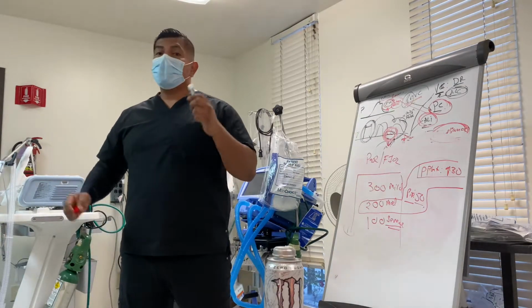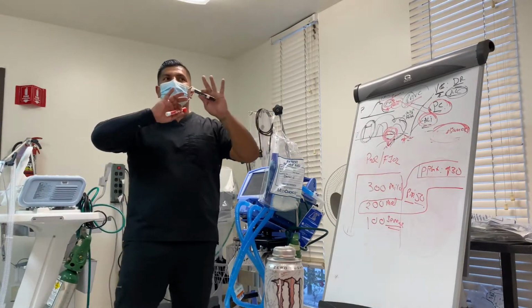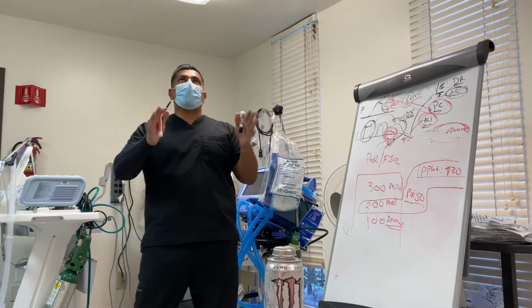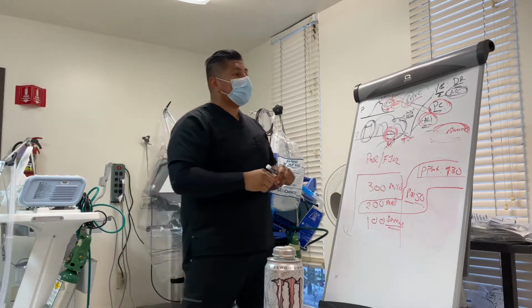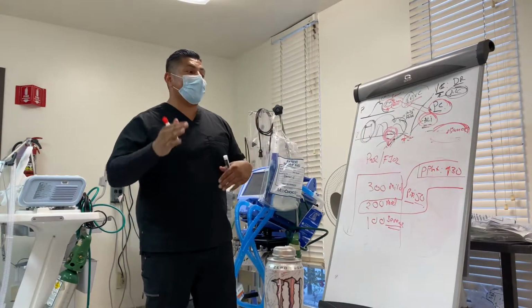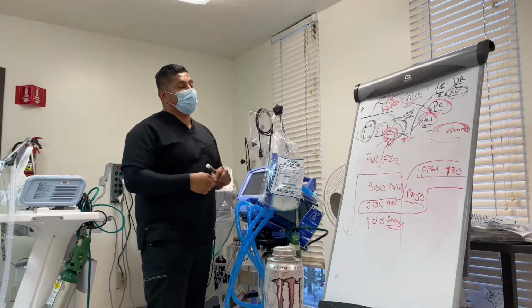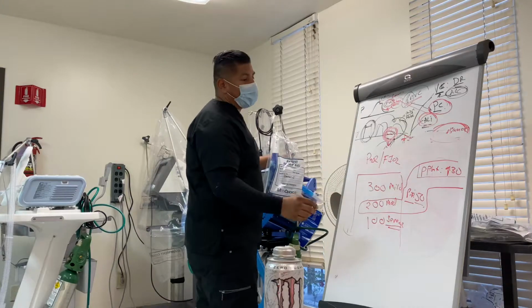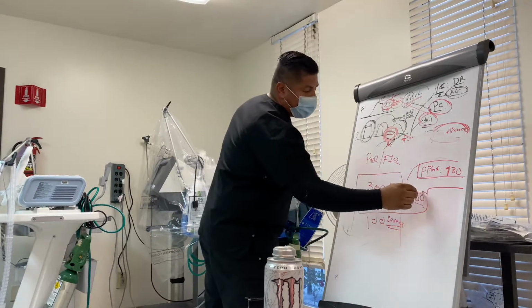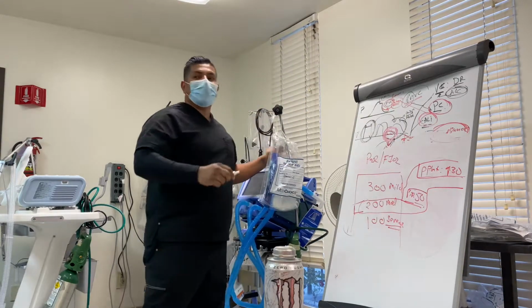Okay. So for the NBRC, you never start with pressure control, because with pressure control there are some things that are different that can cause overall permanent damage. So we're going to look at 3 factors. If your plateau pressures are high, peak pressures are high, and your PF ratio is low, you need to protect that lung.